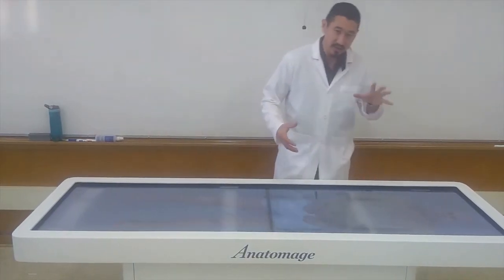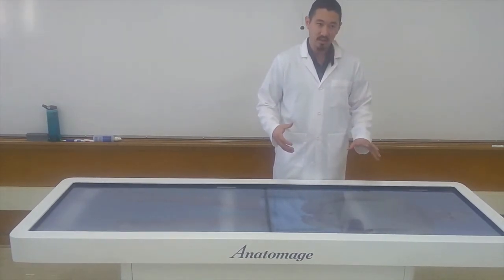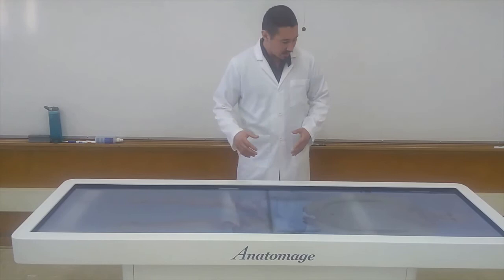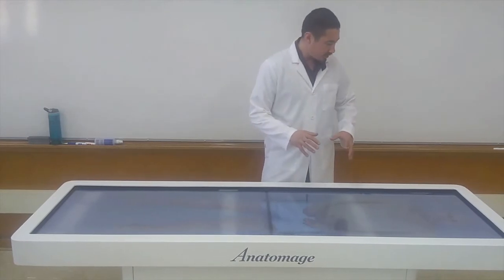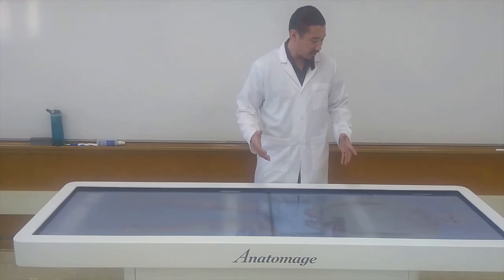We currently have 6 different bodies on here that we can manipulate, plus animals, case studies, different MRIs and CTs and X-rays, all for the kids to manipulate. So let's take a look at just a little bit of the functionality, the capabilities of this table.